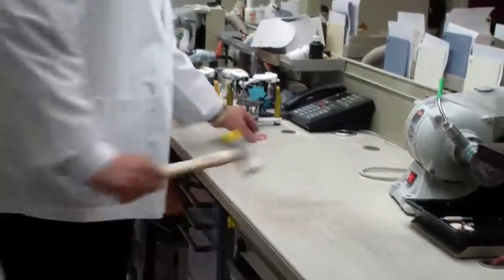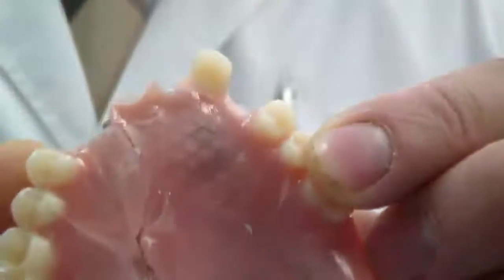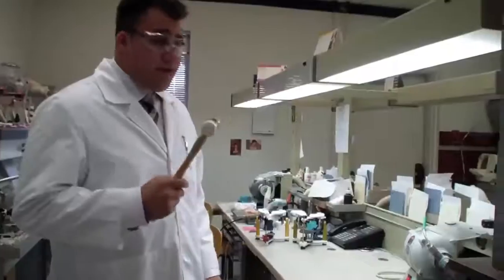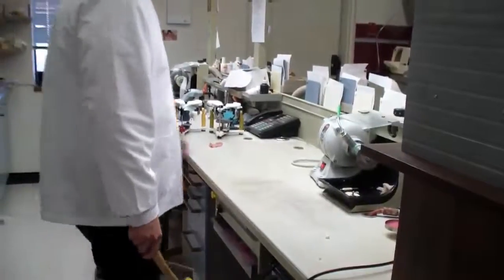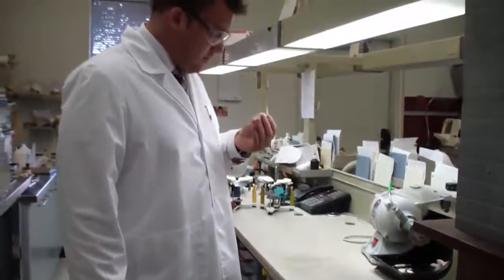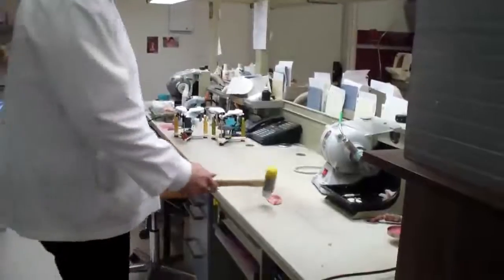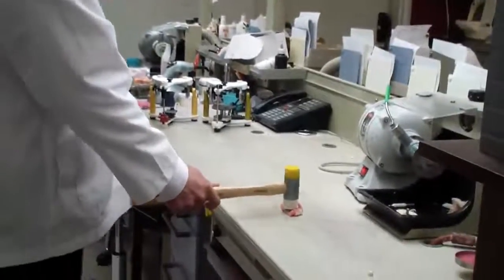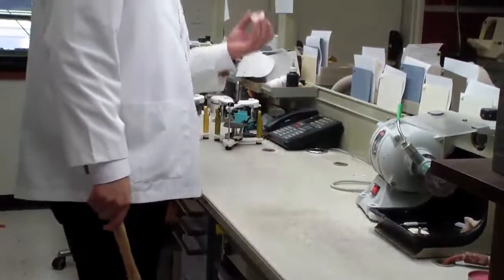Look at that — it shattered. Interesting. Let's see what happens when we hit it again. Cracked a little more, now there's much more little cracks. Third time's a charm. And again, trying to apply as much of the same force as possible, letting gravity take the hammer. And it just continues to break.